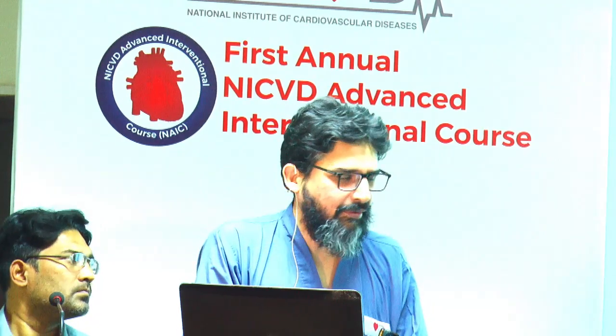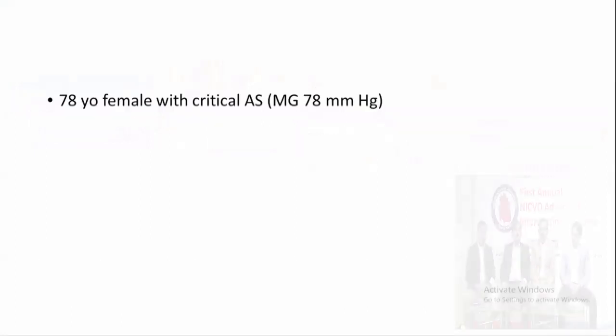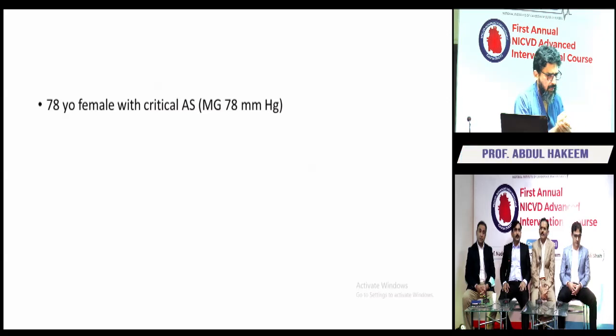We're going to be talking about TAVR. First, I thought I should show you cases that I've done in the past, but we've done a couple of nice cases recently, so perhaps we can discuss them. So we have a 78-year-old female who has critical aortic stenosis.